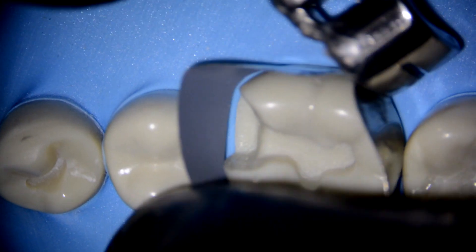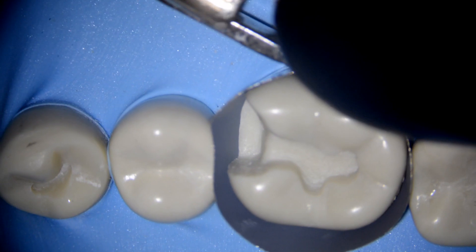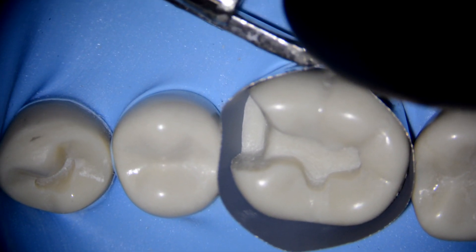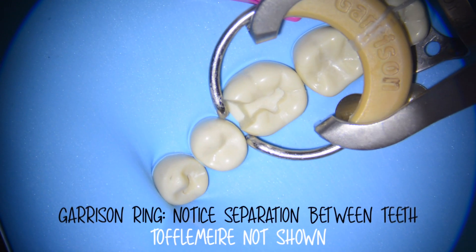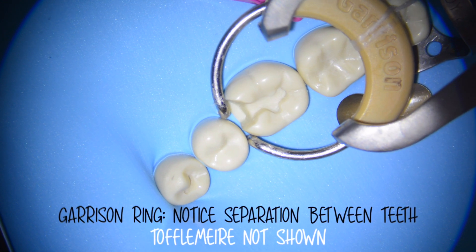The Toffelmire is probably one of the most commonly used tools in dentistry. It wraps around the entire tooth and gives us a relatively easy way to fix a broken tooth. However, it does have its complications. The thickness of the band can prevent dentists from establishing a tight contact, which is why we typically use it with a wooden wedge or a garrison ring to create a slight separation between the teeth and compensate for the relative thickness of the Toffelmire.